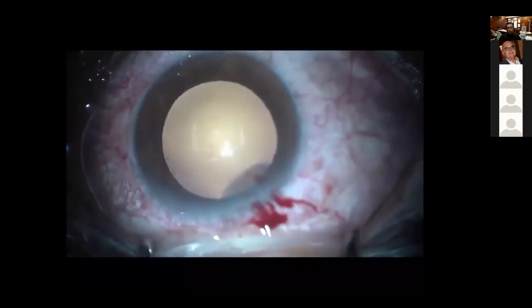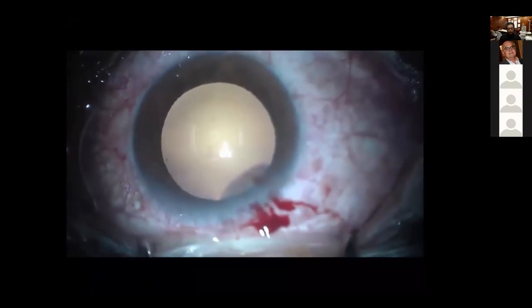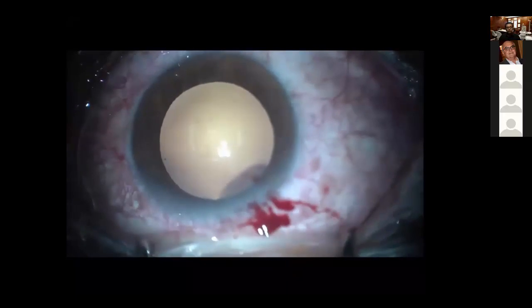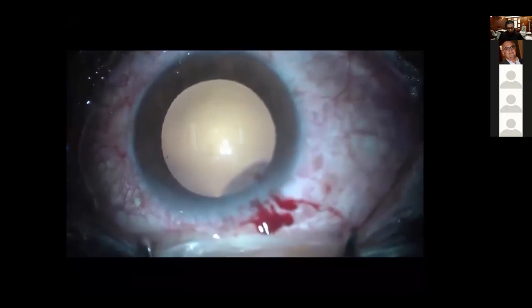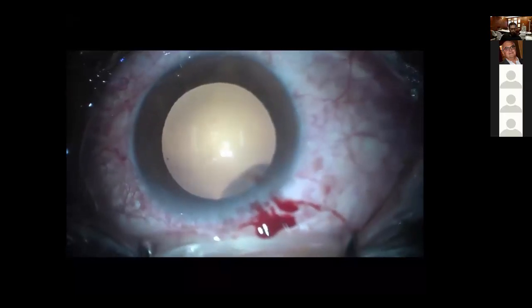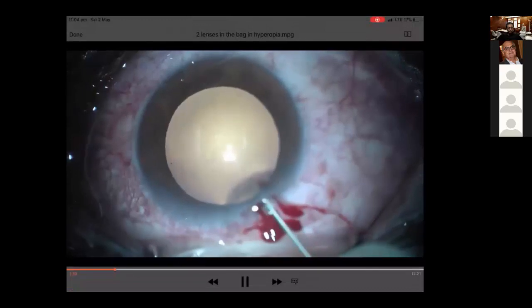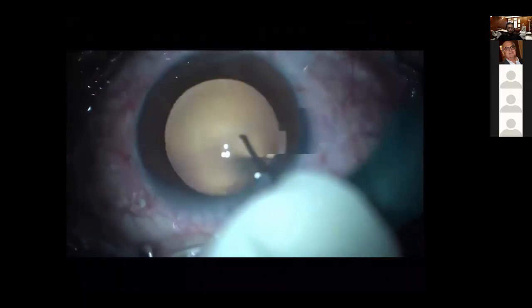I usually do my cases with both lenses in the bag as I achieve good centration this way, because in doing one in the sulcus and one in the bag, sometimes they do not center in front of each other quite well. And most of the visual results in such cases, I find them to be satisfactory and convenient.